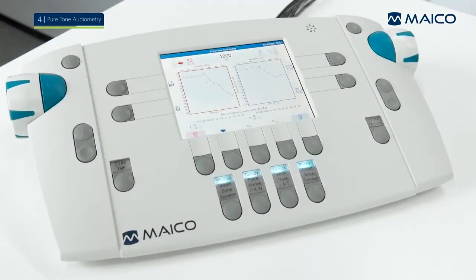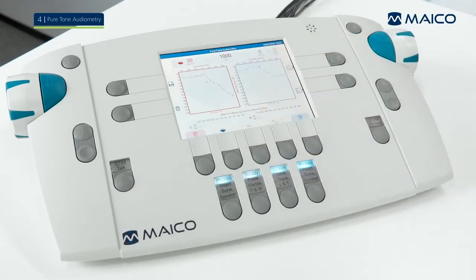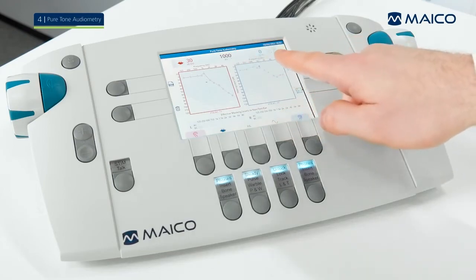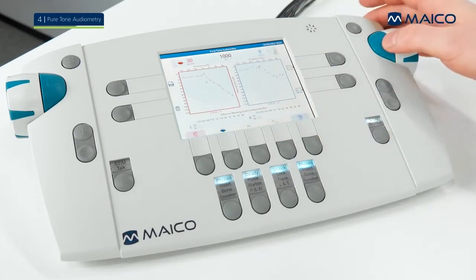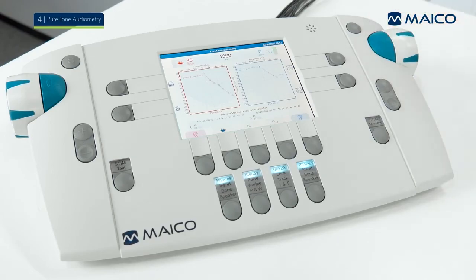The pure tone audiometry test screen is divided into several sections. The numerical bar gives a quick overview of the test parameters of the two channels: frequency, level, stimulus type and indicator. The stimulus indicator lights up when a stimulus is presented. When the patient response switch is pressed, the patient response indicator is displayed above the numerical bar.